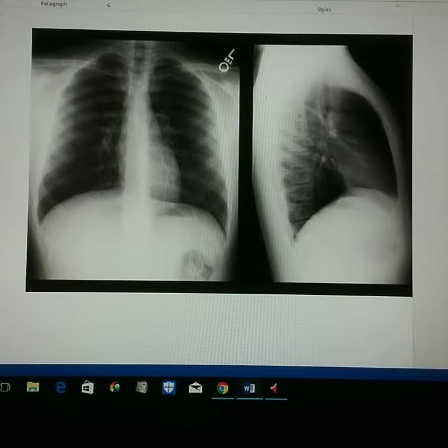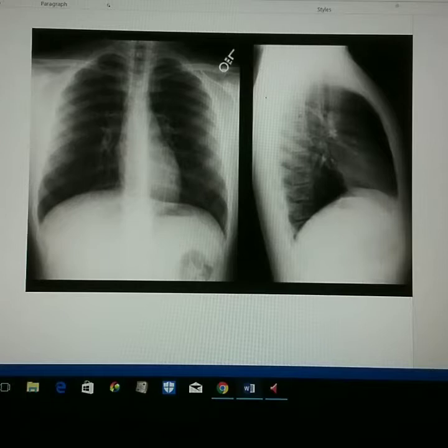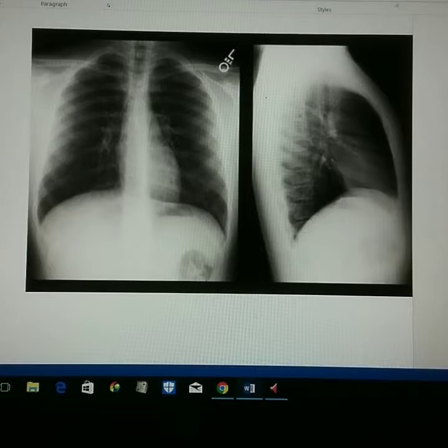Moving to our lateral chest view, again we want to make sure we have proper collimation. We want to make sure that our arms were out of the lung field during the exposure, so no arms are overlapping any of the superior lung field. The costophrenic angles and lower aspects of the lungs are in view.